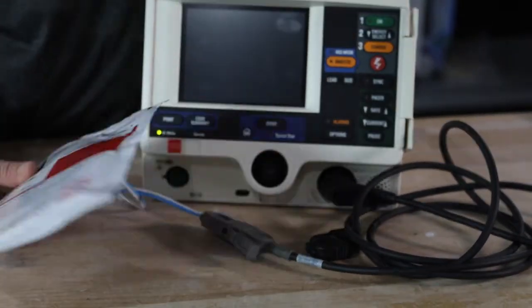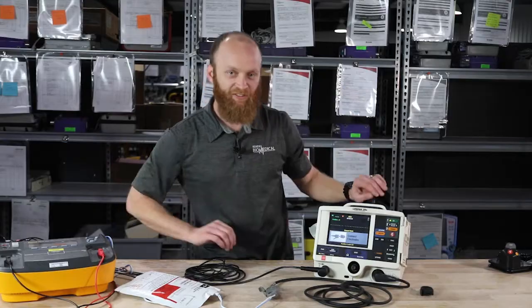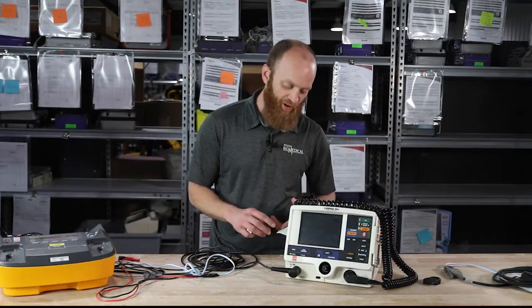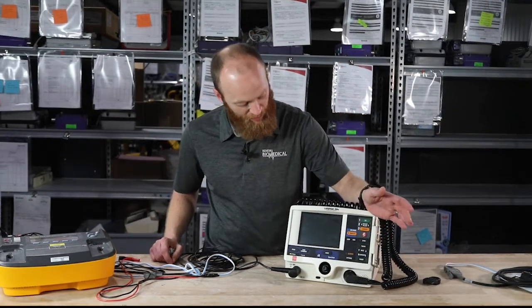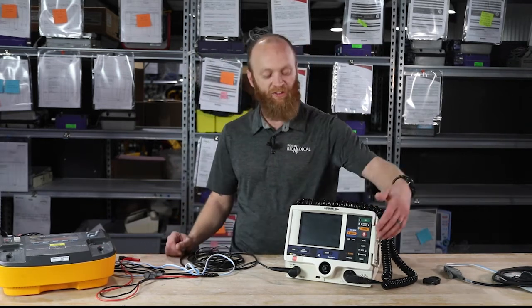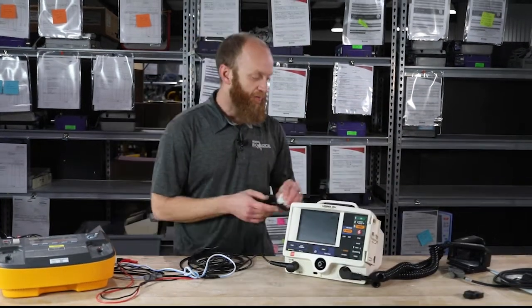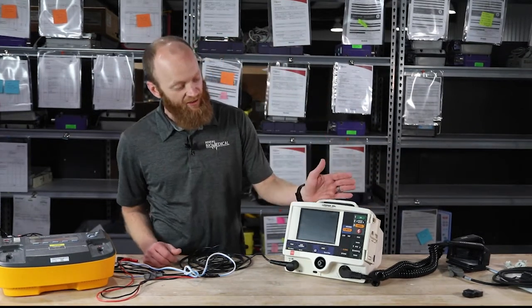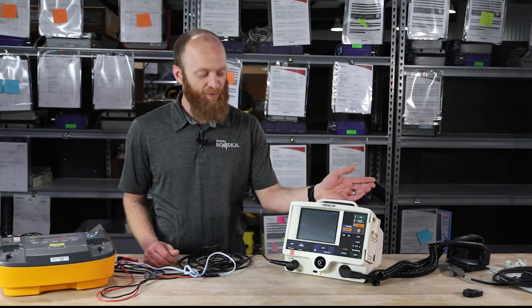They plug right into your therapy cable — sternum apex — stand clear, charge, shock. To perform the self-test with the paddles option, go to options and scroll to user test. No different than your therapy cable and test plug, but you do have to have the paddles plugged in, and you get the printout. All configurations have three-lead, five-lead, pacing, defib, and sync. You can get them without pacing.